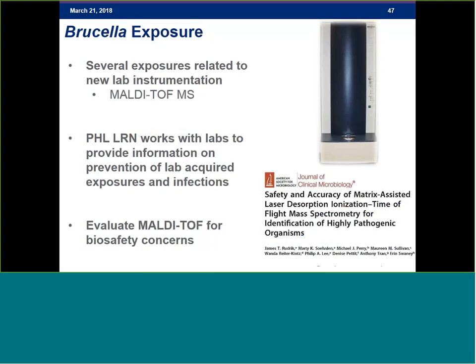Something to note, we have not had any cases of seroconversion in the last 10 Brucella exposure cases. However, members of the Laboratory Response Network have worked with labs to provide information on prevention of lab-acquired exposures and has recently conducted a safety study focusing on MALDI-TOF for biosafety concerns.